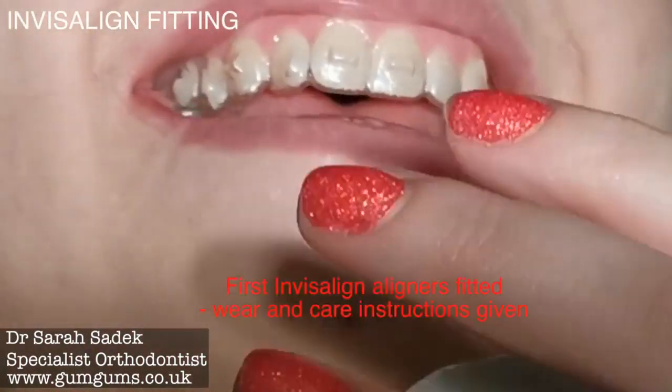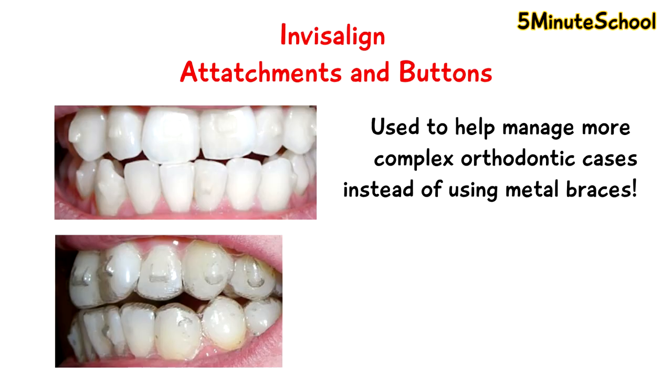Once they're in the right position, these attachments are quite good at creating new angles of pressure to direct your teeth specifically in the right place. For example, if your teeth are particularly crooked in one area, or if you have some crowding where we need to start rotating teeth, then attachments are quite good at redirecting the forces to align your teeth into the correct position.